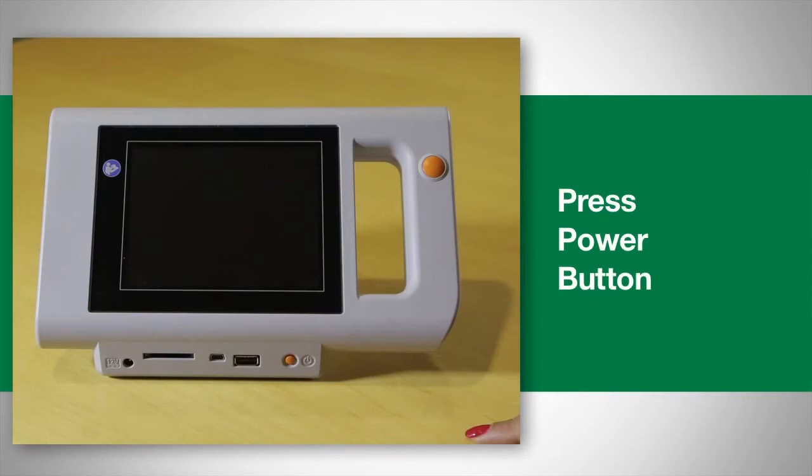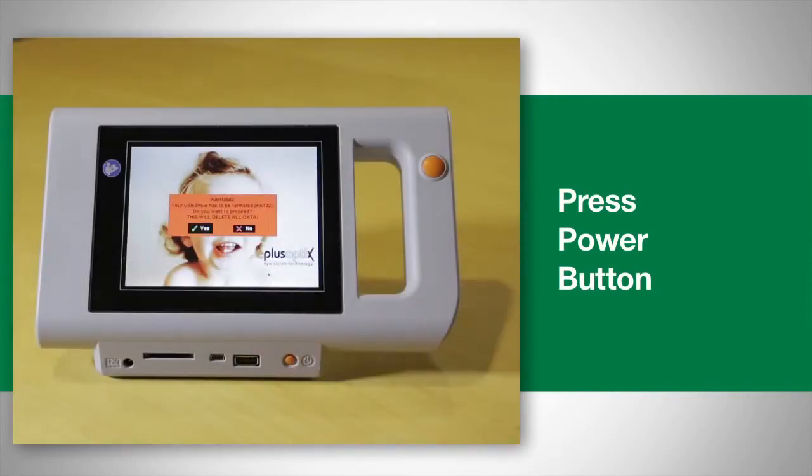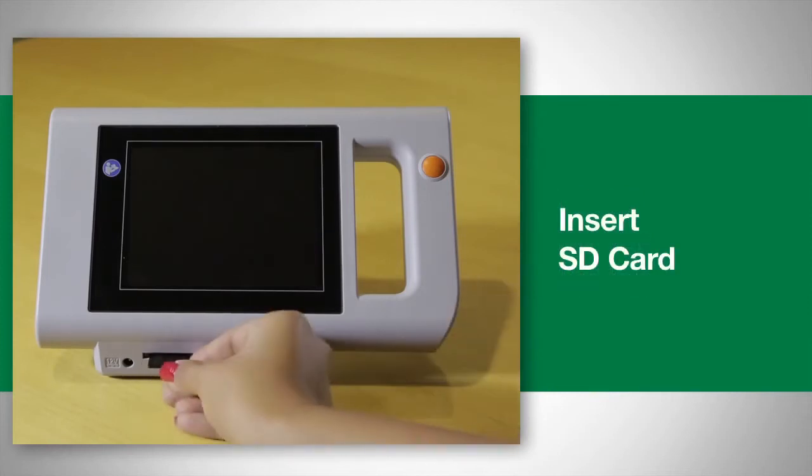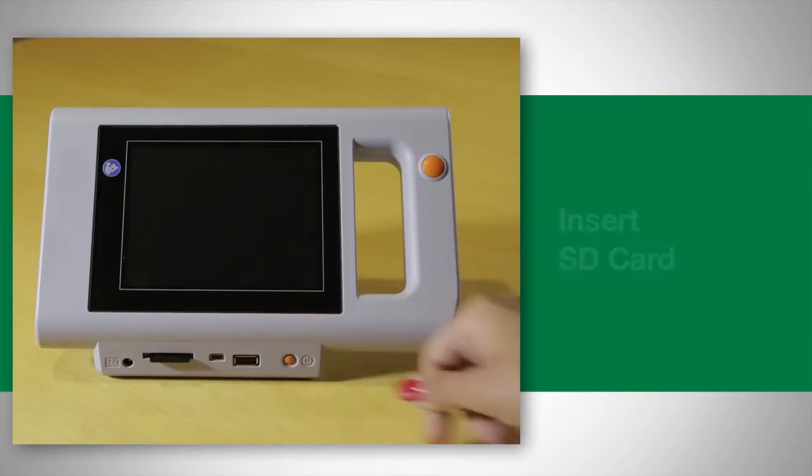To screen a child, begin by pressing the power button. If the SD card is not already placed into the device, insert the SD card upside down into the device before screening a child.